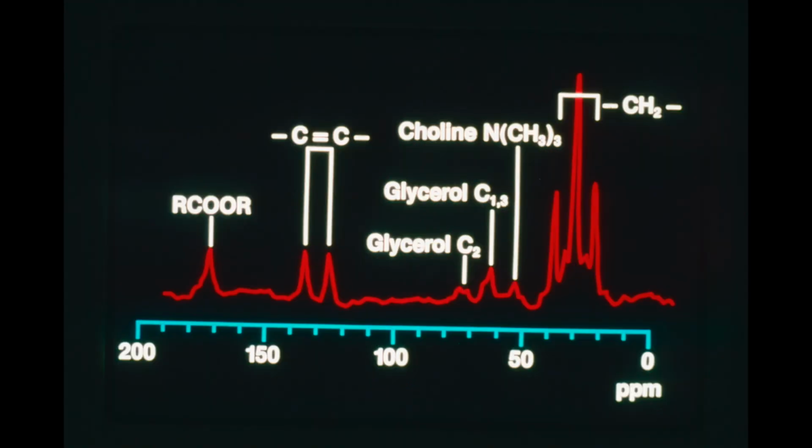This is a carbon-13 spectrum of the temple. This has coupling still present. This is the resonance from normal fatty acid chains. The reason there are 3 peaks is because of the 2 protons that are attached. Decoupling would remove this, but it would also heat up the individual. We can pick out other signals from other carbons as well.